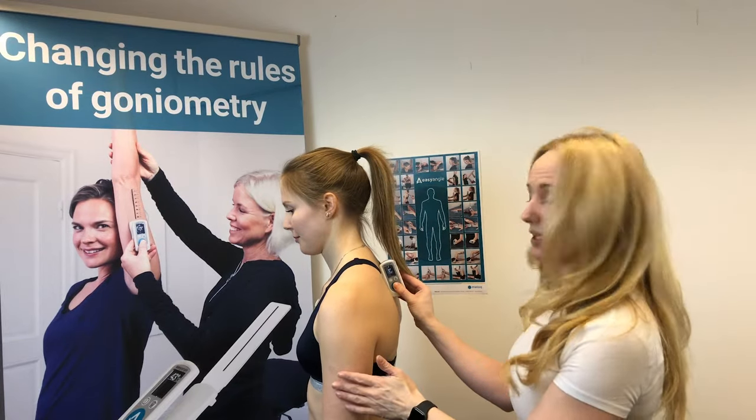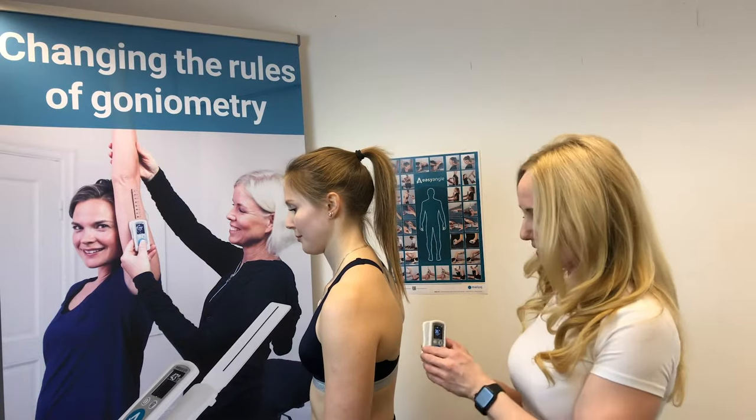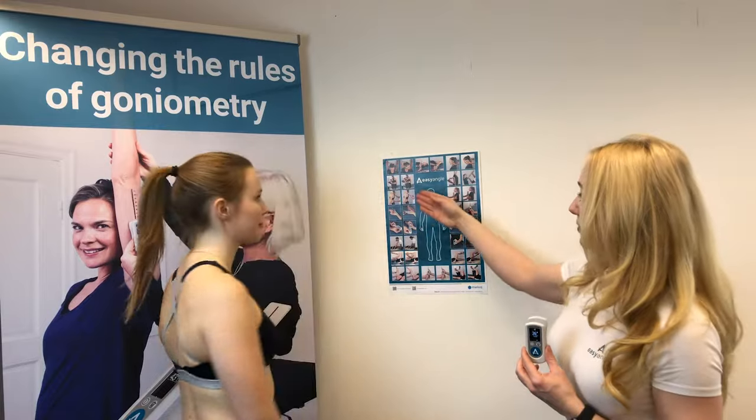We press the button and then we take it down to the base of the kyphosis, we press the button and we get our measurement. This is demonstrated right here on the measurement poster.